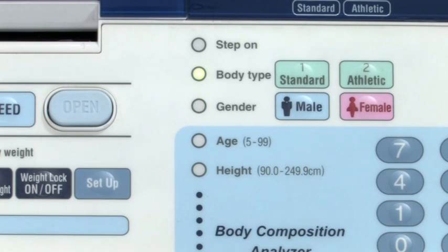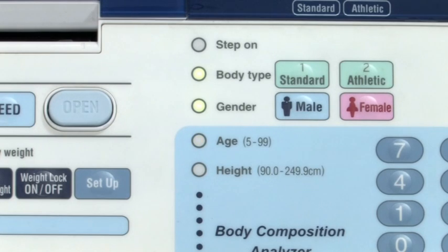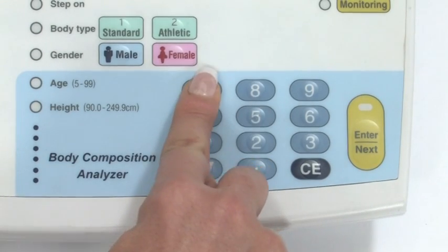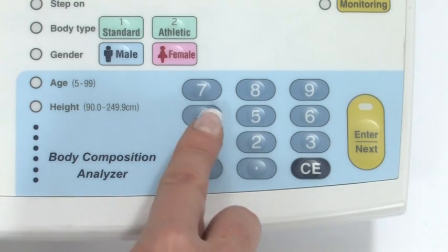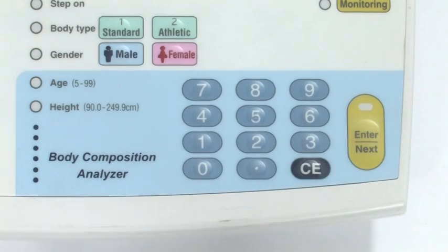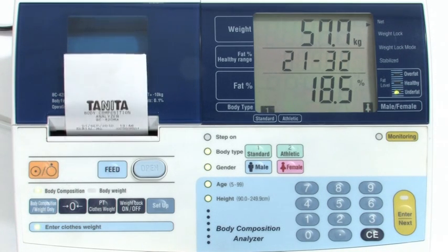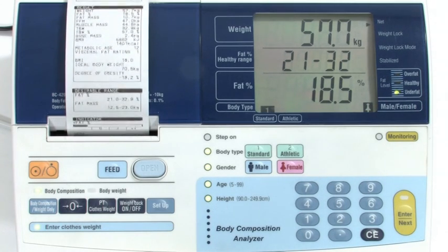Next, the gender indicator will flash — press male or female. Input age between 5 and 99 years, then press enter. Input height, then press enter. A measurement is now being taken. The body composition results will start to print automatically. After 20 seconds, the analyzer will then be reset to zero, ready for the next measurement to be taken.